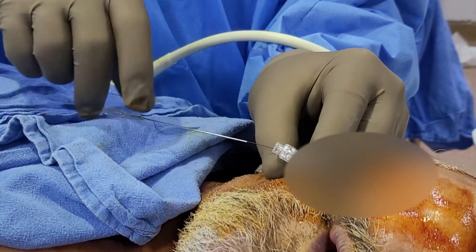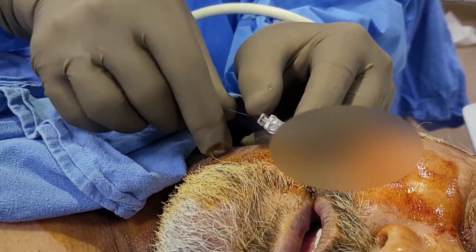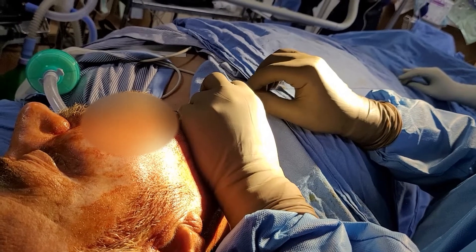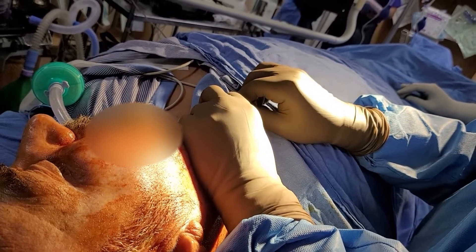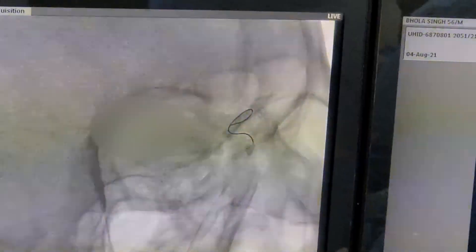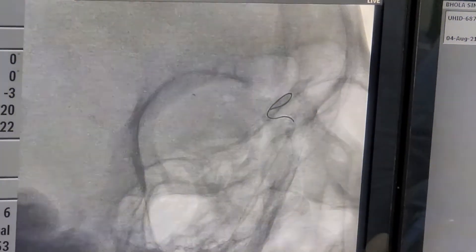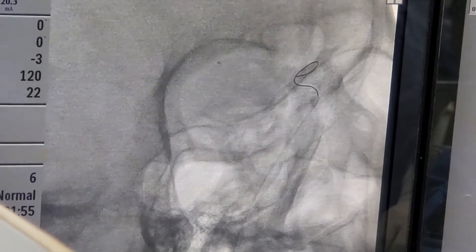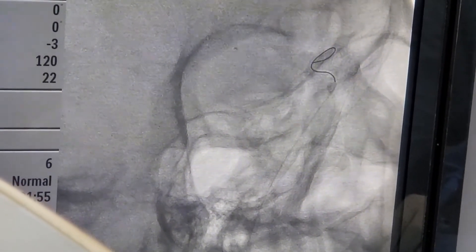Once the soft 0.014 wire is inside and a little deeper, we put it in using an introducer. See, we're pushing it now — the dark part is quite deep and then there is a little stiffer part which is into the vein. Then we put in a soft dilator inside, till the curved part.